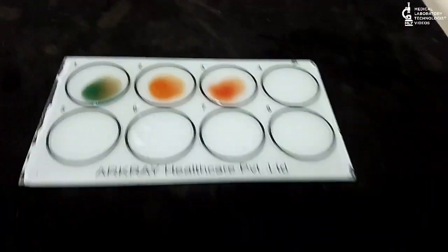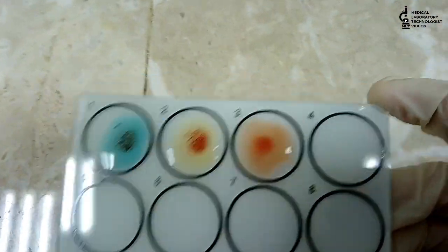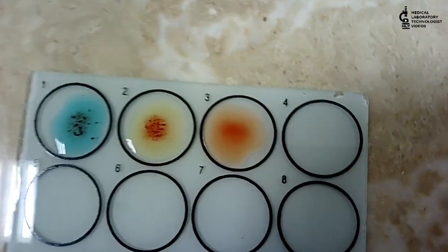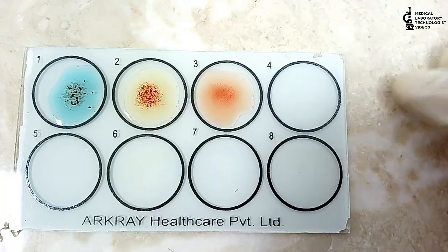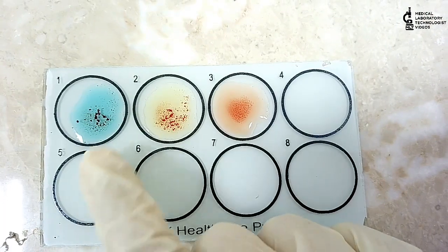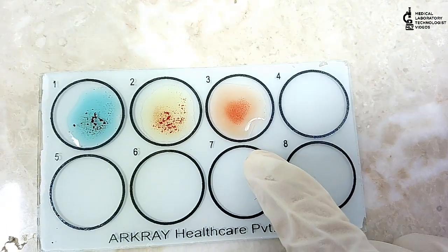After one minute, you can see that agglutination has appeared in all three circles — A, B, and D. This means our reagents and anti-seras are okay to use in the lab. You can see more visible agglutination in anti-A, anti-B, and anti-D sera. Agglutination must appear for us to confirm that our anti-seras are working well.